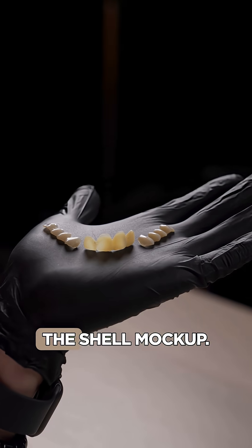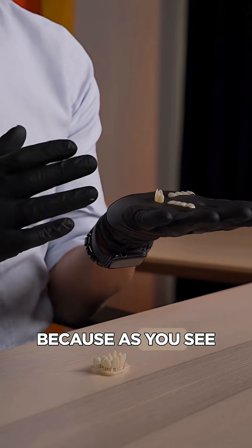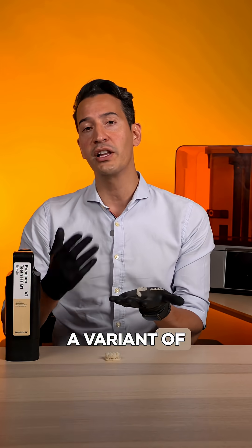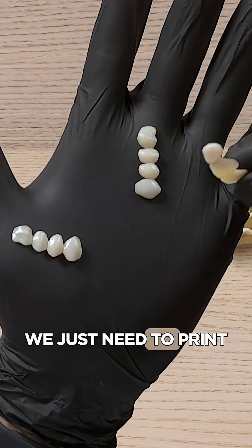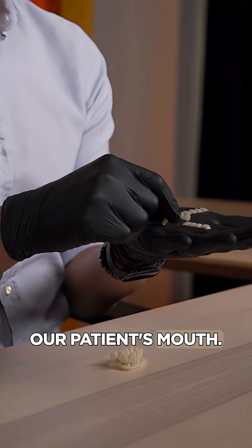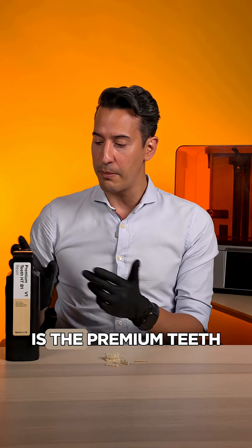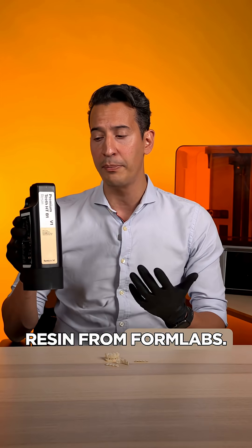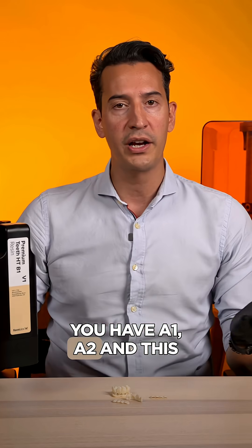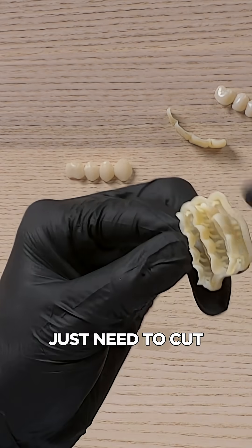Skip the model and try the shell mockup — this is the most efficient option because we don't need the model, we don't need the index. This is a variant of the previous one. We just need to print these small three pieces and bond them into our patient's mouth. For this, we are going to use this resin — the premium teeth resin from Formlabs. In this case, this is the B1 color; you also have A1 and A2.